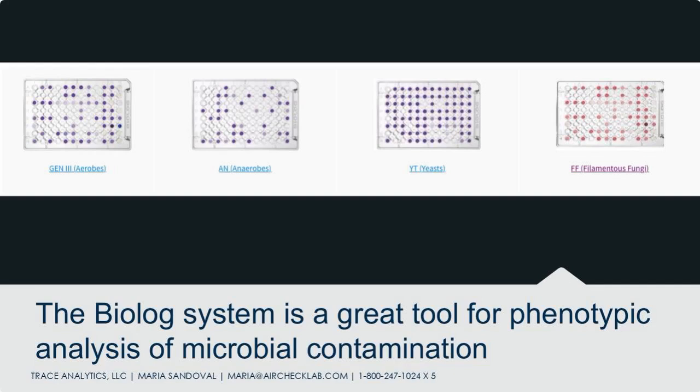And so once we get those plates in, and if we have a colony that is present on that plate, then we know as the lab, all right, these guys want to do confirmatory identification of this colony that was isolated in their anaerobic test. And so we would use this 96 well plate to do that. And this color profiling is a phenotypic identification of the organism. And it comes with a qual value, which is a qualifying value that gives you the assurance based on that organism and the library that is present.